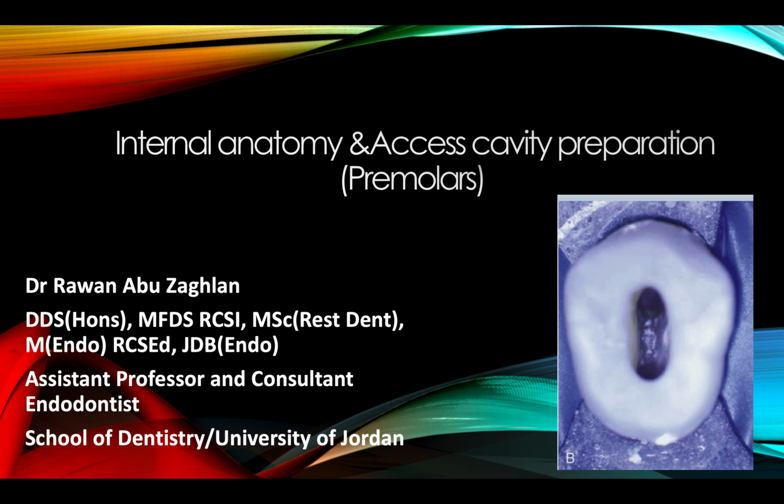Hello everyone. In this video, we will talk about access cavity preparation in premolar teeth. First, we will briefly touch upon the anatomy of each premolar tooth. Then we will describe the steps and the armamentarium required to prepare access cavities for these teeth. Let's get started.